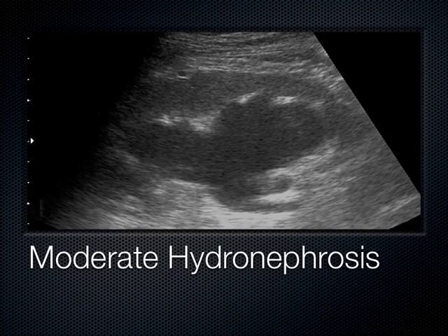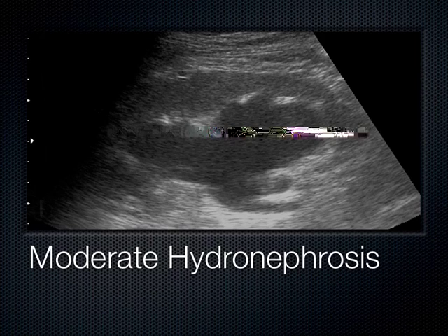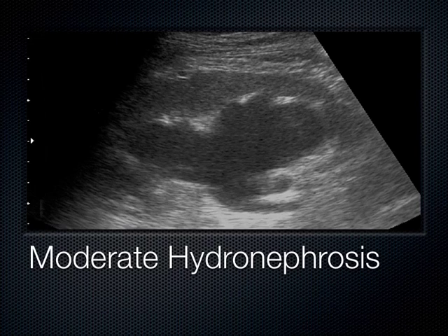With a lot of hydronephrosis backing up in the kidney, the cortex starts to go away and those finger-like projections coalesce into one. We can still make out cortex here. If all I saw was a big black center with no cortex left, that would be severe hydronephrosis. The fact that I can still make out cortex tells me this is probably moderate.